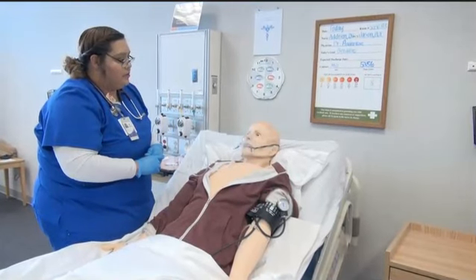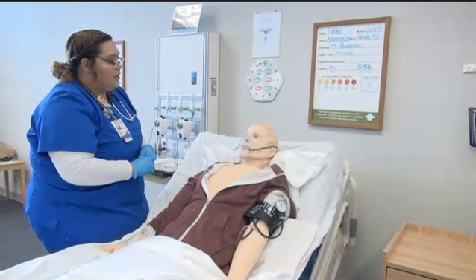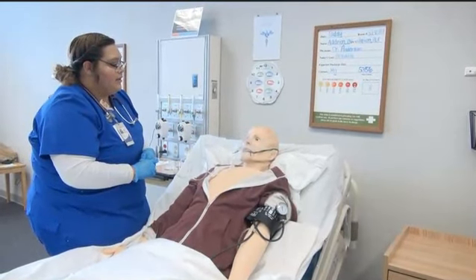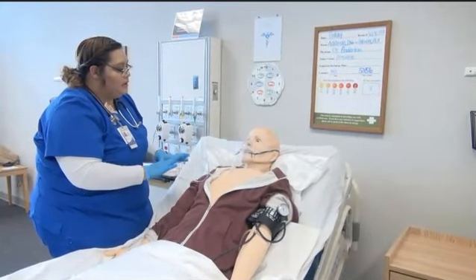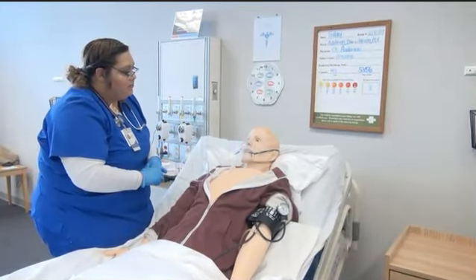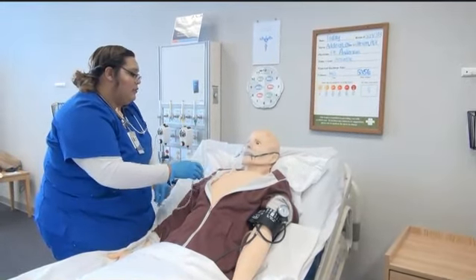1, 2, 3, 4, 5, 6, 7, 8, 9, 10. Okay, slowly go ahead and breathe out. Good job. And we're going to let the medication run.